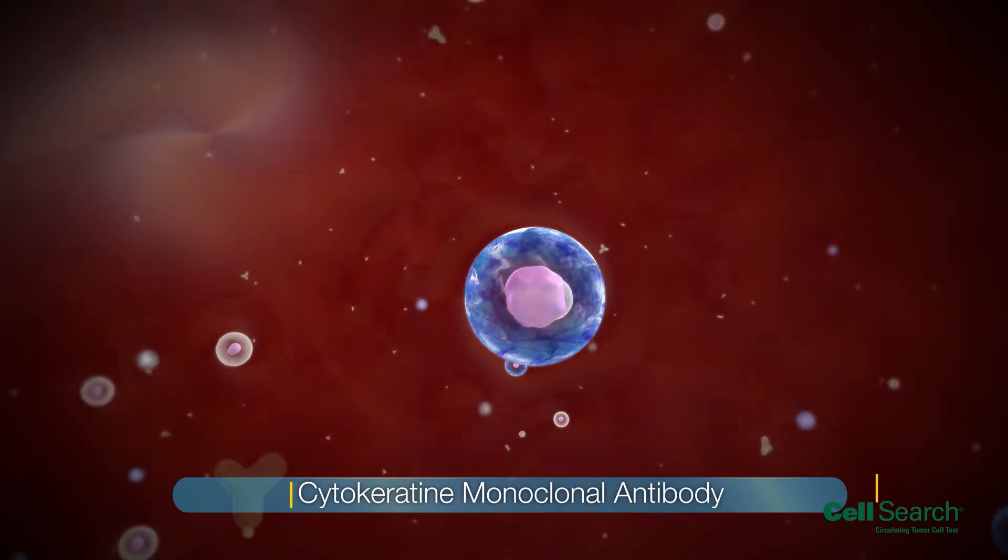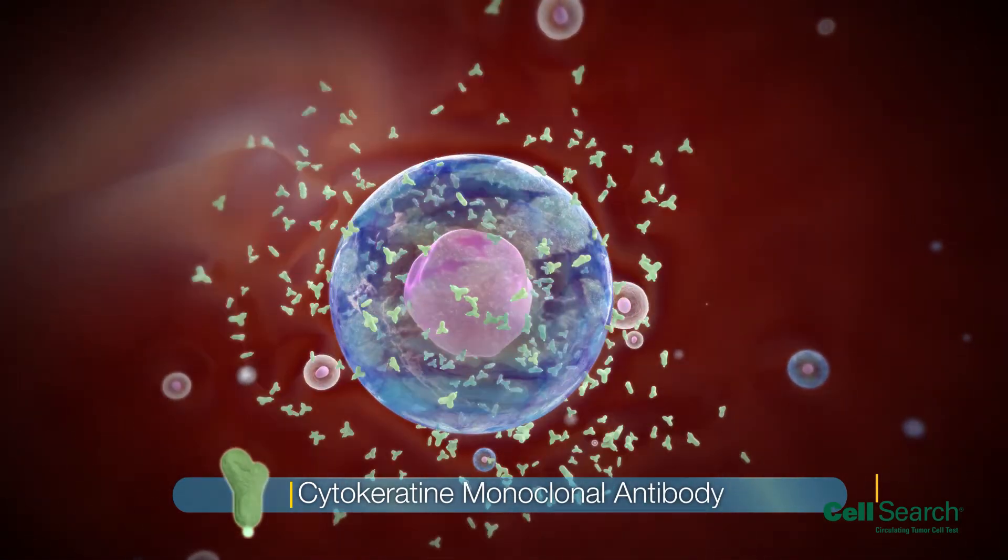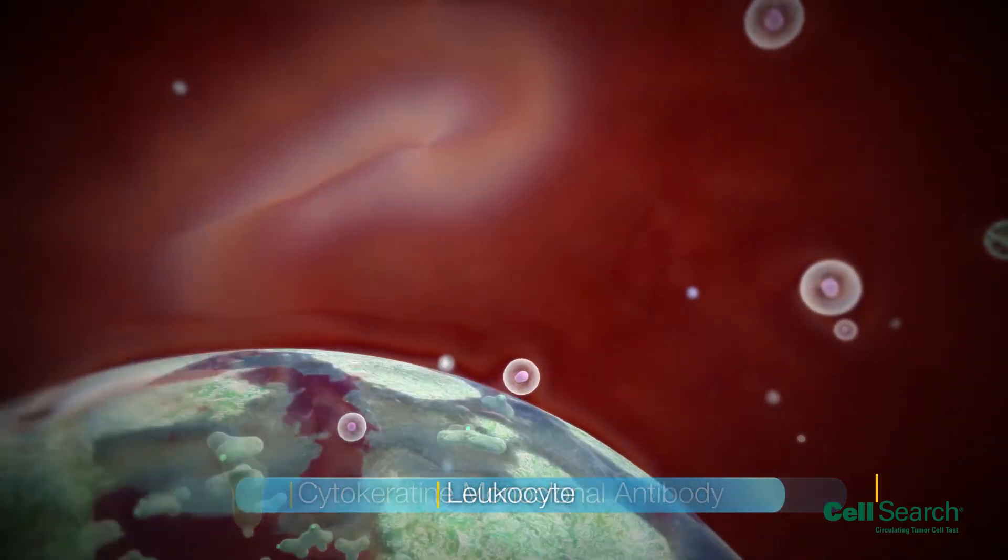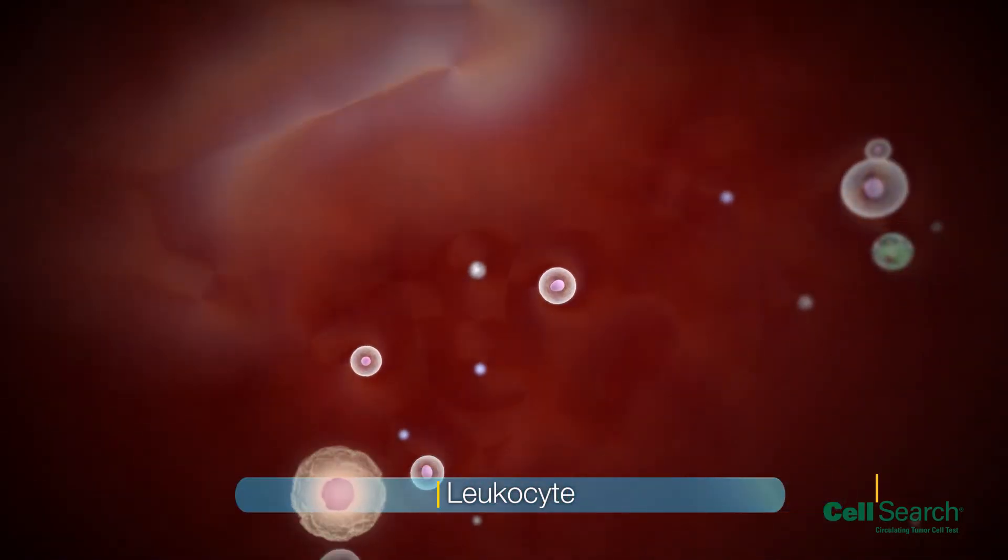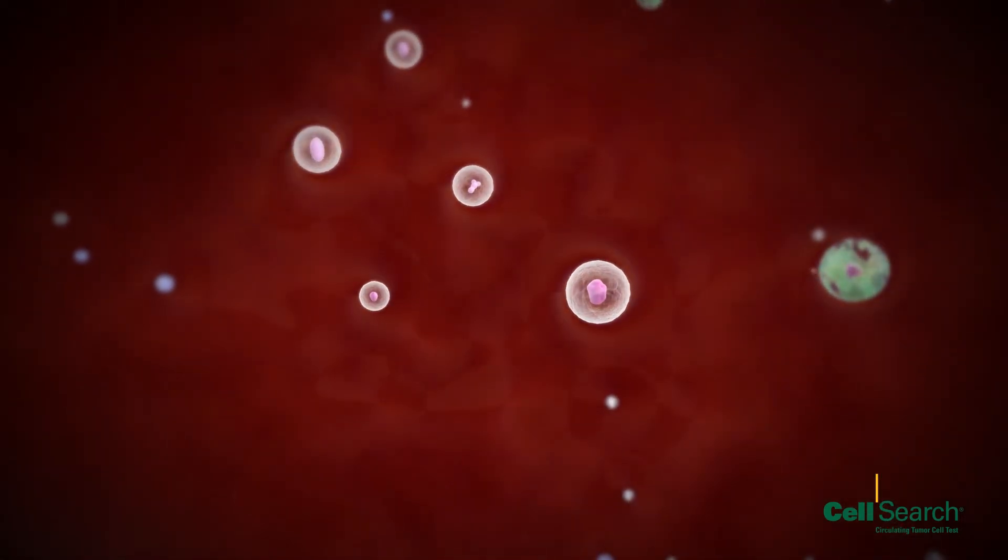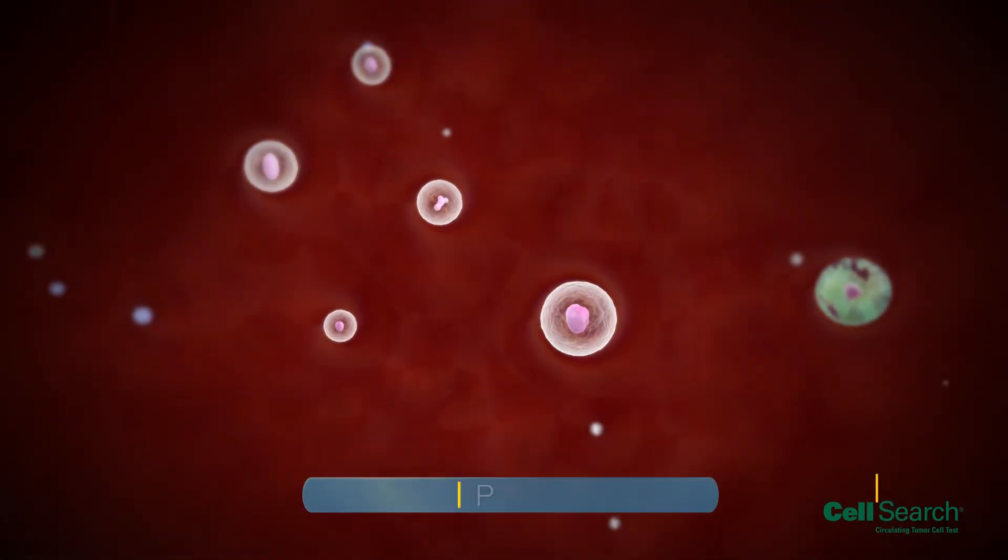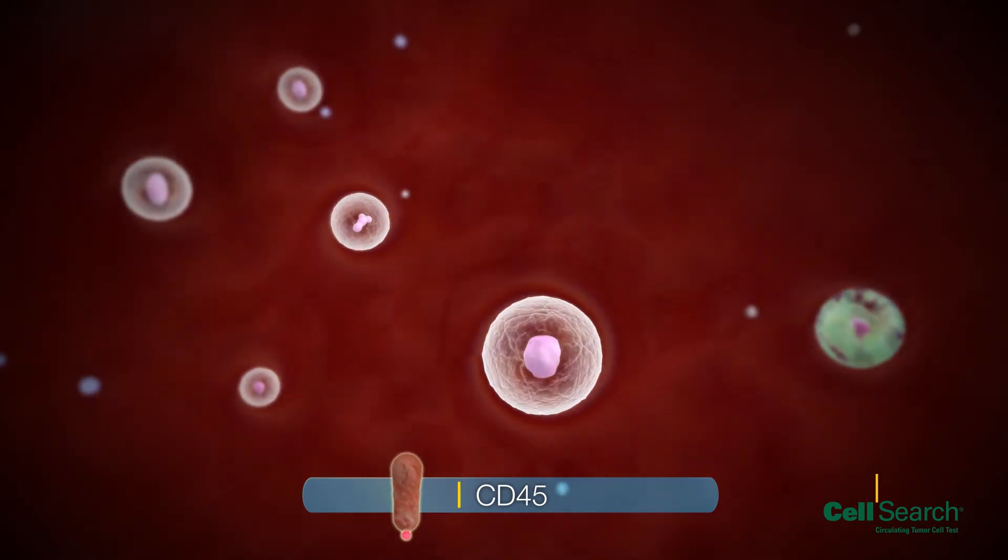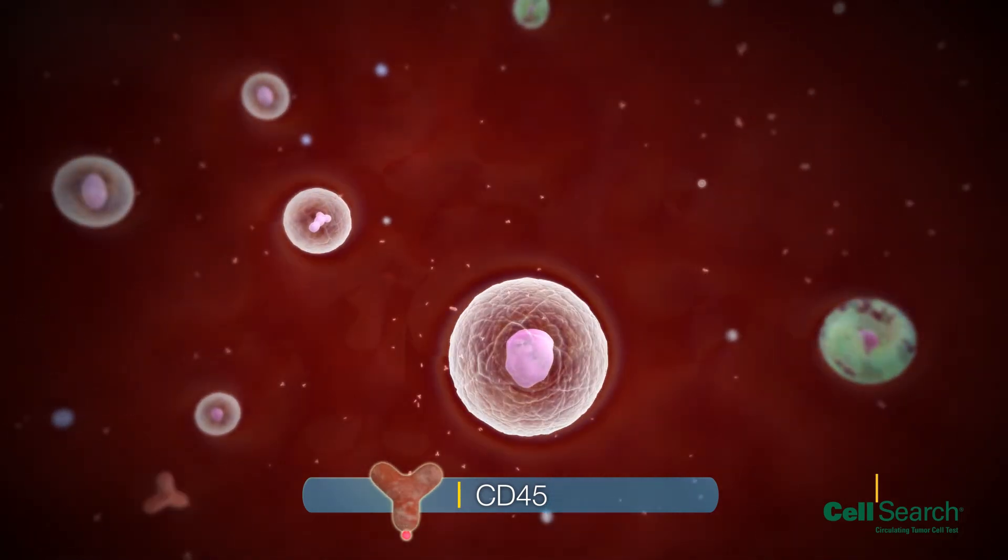CTCs are then stained with cytokeratin monoclonal antibodies, which are specific to epithelial cells. To distinguish contaminating leukocytes from CTCs, a pan-leukocyte monoclonal antibody called CD45 is also added. Finally, cell nuclei are stained using a DNA stain called DAPI.